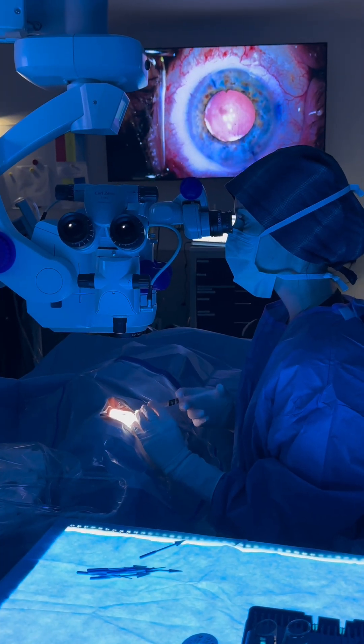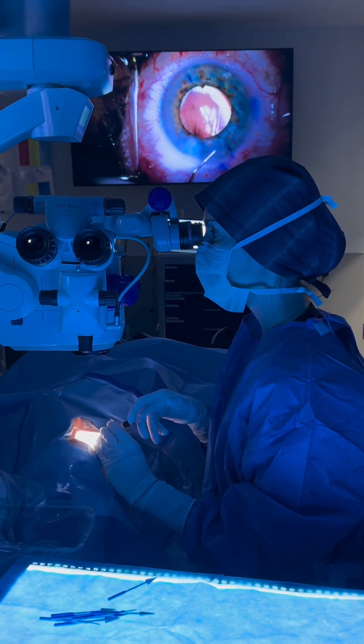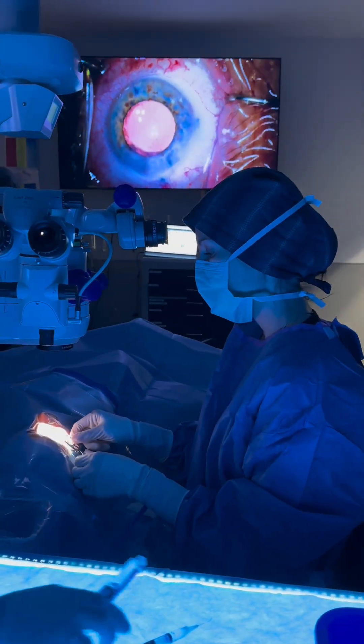Because the wound is so small — it's only 2.4 millimeters — we can actually just hydrate the wound closed. There are no stitches needed. That looks great, and we're all done. Everything went very well.